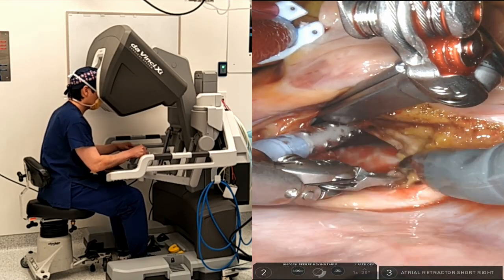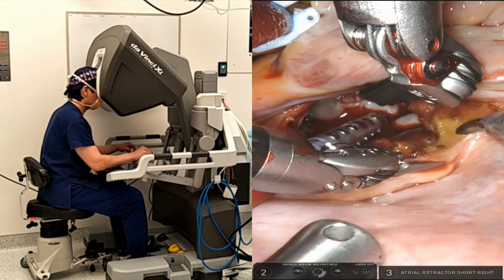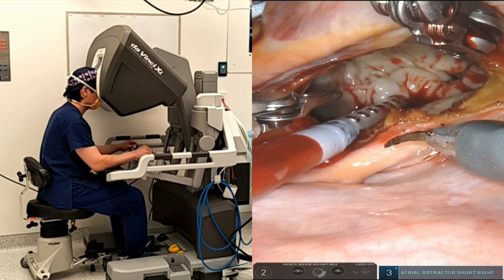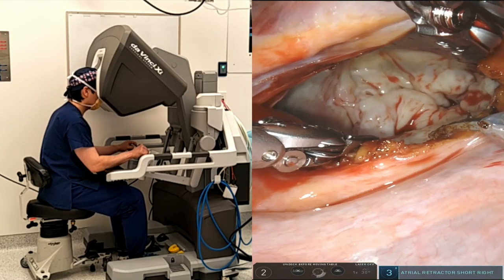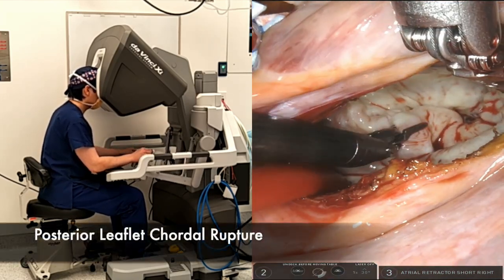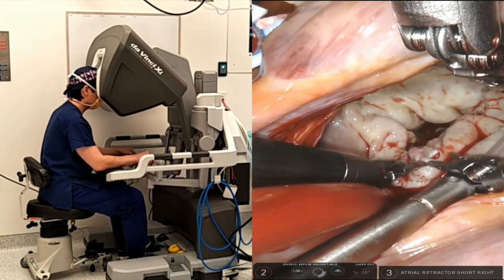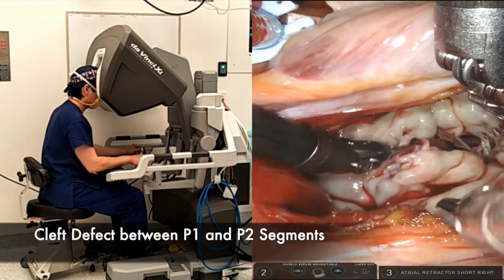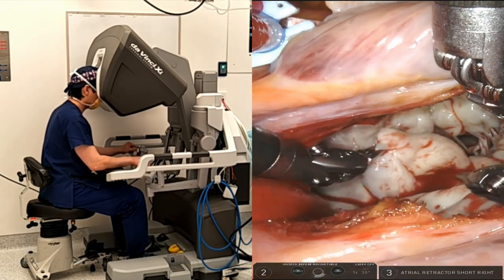I usually don't go behind the oblique sinus, as I generally find this extended left atrial incision is adequate for the majority of cases. Here I was performing a mitral valve analysis, which clearly demonstrated ruptured cordy from the P2 segment. In addition, you may appreciate from the visual cues that the P1 segment was tethered down with some fibrosis and calcification involved in the subvalvular apparatus. There was also a cleft between the P1 and P2 segments.